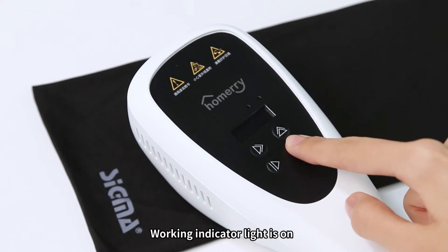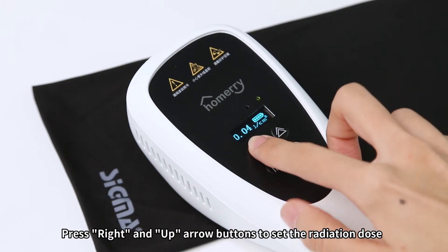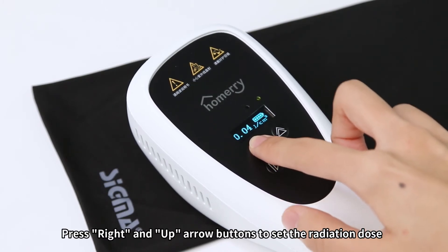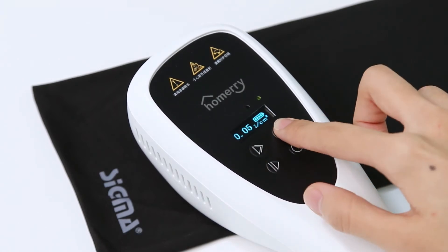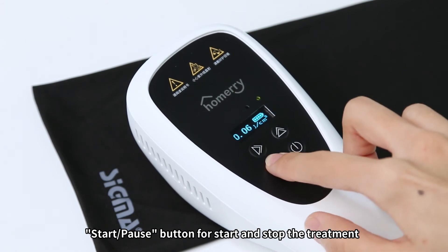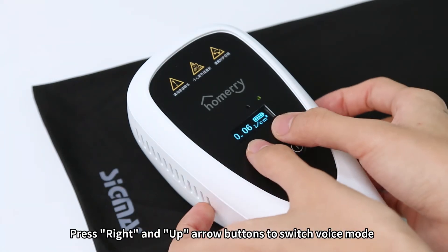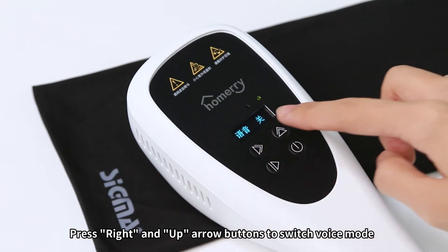Turn on the device and the Working Indicator Light comes on. The Sigma trademark flashes on the Display Screen. Press the Right and Up Arrow Buttons to set the radiation dose. Use the Start/Pause Button to start and stop the treatment. Press Right and Up Arrow Buttons to switch Voice Mode.